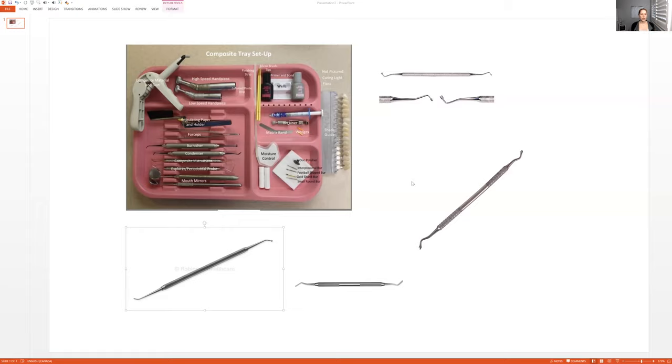So let's walk through the procedure. The dentist may apply the rubber dam — this isn't shown either. Sometimes they use the rubber dam, sometimes they don't. The dentist will let you know. I have a separate video on how to apply the rubber dam and how to punch it, so if you need help, let me know. But let's just say they're not using the rubber dam.